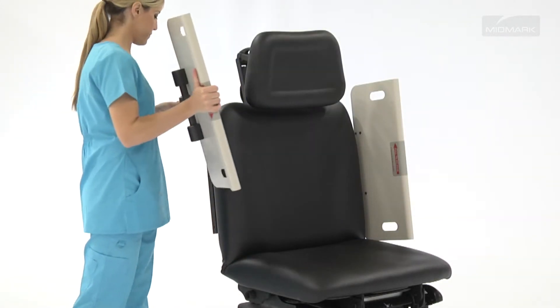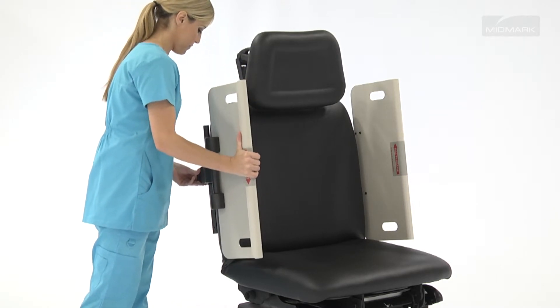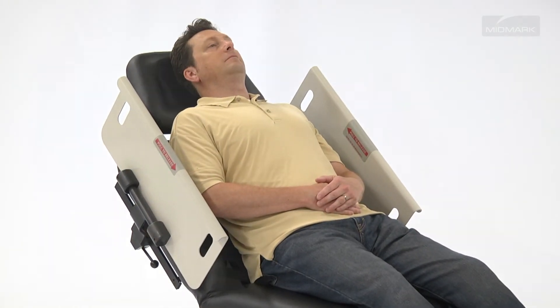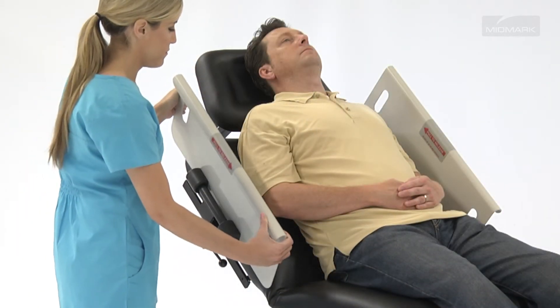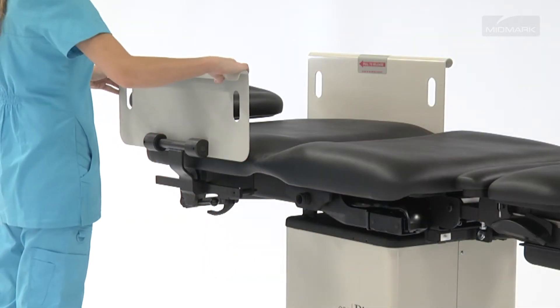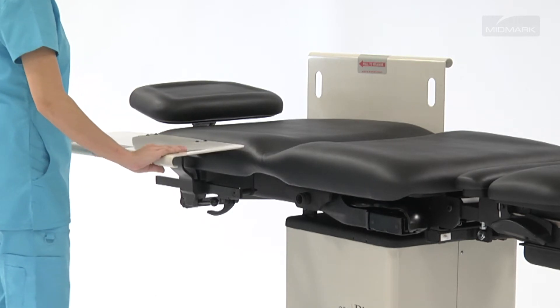Attaching Security Side Panels to your 230 Procedures Table provides a safety barrier at the sides to help keep patients secure and reduce anxiety during procedures. When the panels are in the vertical position, they are designed to give patients extra side-to-side security. With the table in the flat position, the side panels can be folded flat with the table and can serve as an extra work surface.